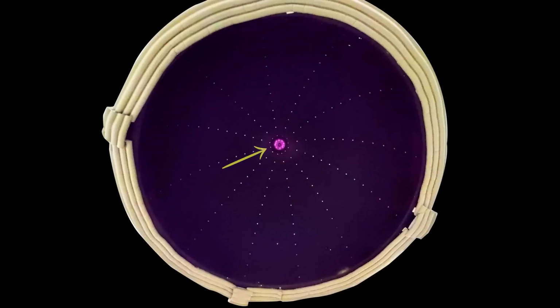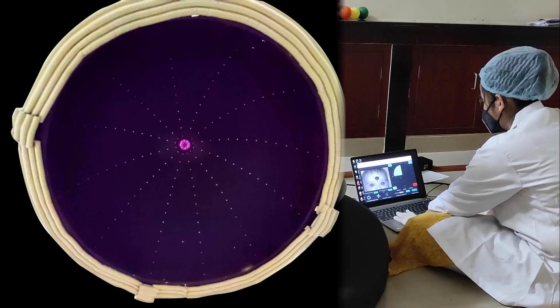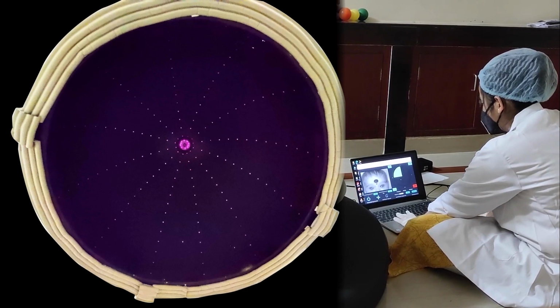Static stimuli include LEDs displayed in one of the four quadrants or one of the cardinal meridians. The kinetic stimulus consists of a single LED lighting up sequentially from the periphery to the center in each of the meridians. The infrared camera mounted at the apex of the dome allows the examiner to watch the real-time video on the graphical user interface.